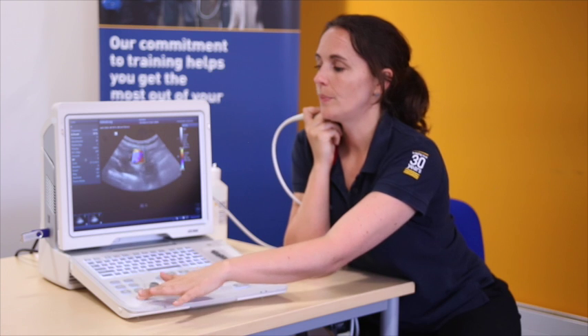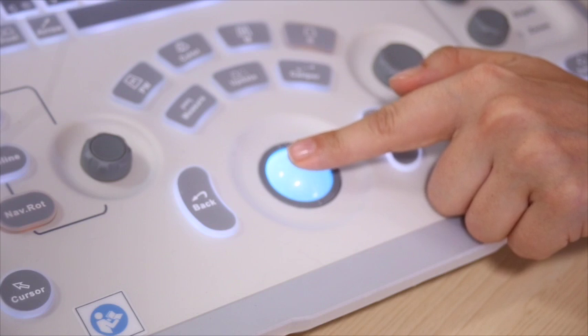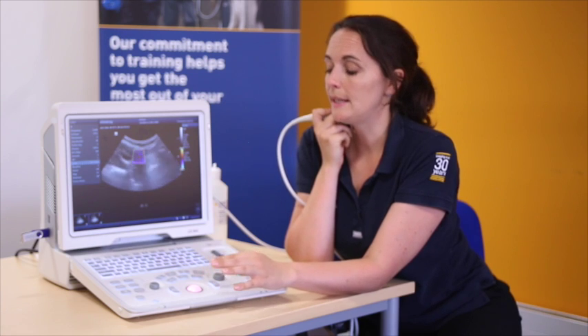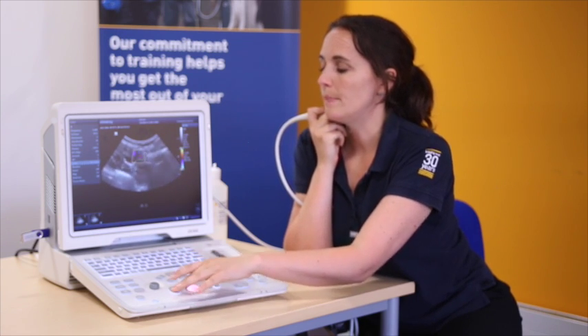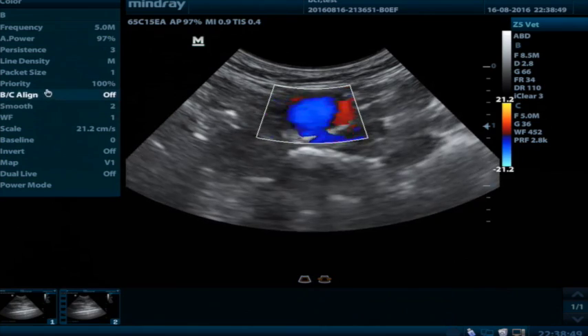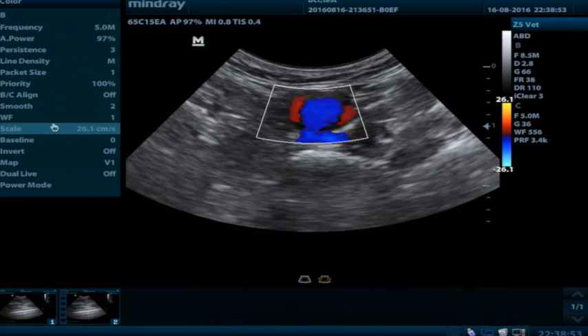I can then change the scale as appropriate by hitting the cursor button, going to the drop-down on the left-hand side of the screen, going to scale and using set to increase the speeds and back to decrease the speeds. I can then change my wall filter, packet size, and line density as required.